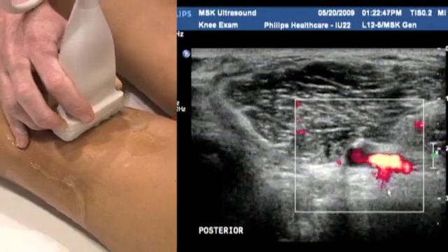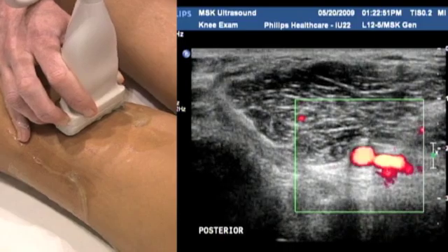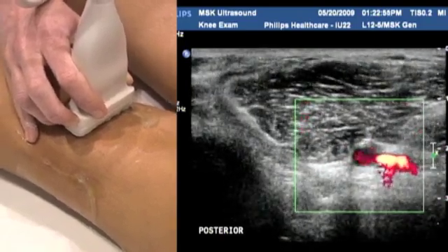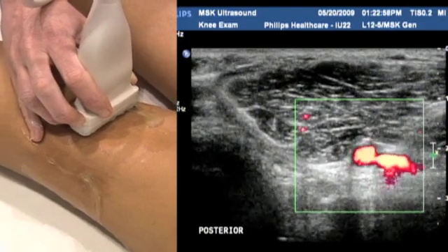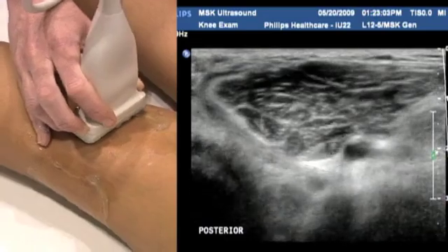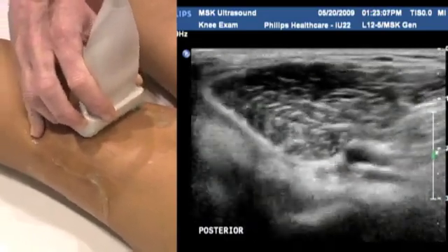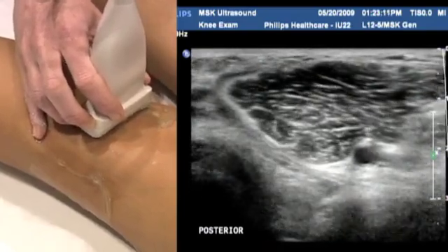So just extending your study a little bit further, giving the radiologists a little bit more information, you can assess the popliteal artery certainly for aneurysm, certainly for any plaque, and again the vein, certainly looking for any thrombosis, and making sure obviously that the vein is easily compressible as part of your deep venous thrombosis study that most sonographers would be familiar with.